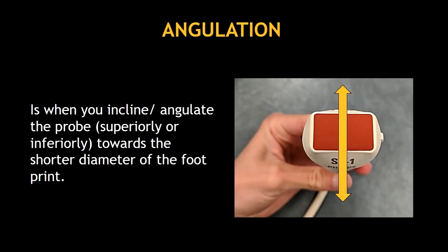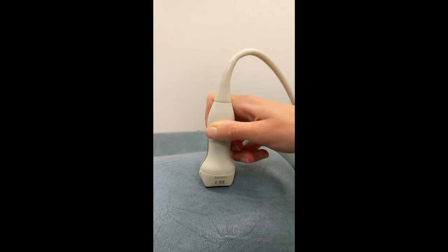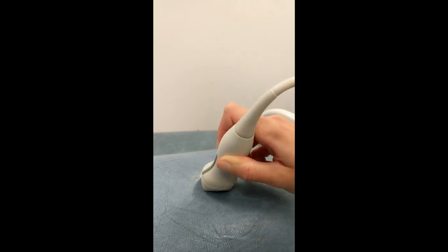Angulation is when you incline or angulate the probe towards the shorter diameter of the footprint. You can angulate the probe superiorly or inferiorly. In this video you can see how I'm angulating the probe.